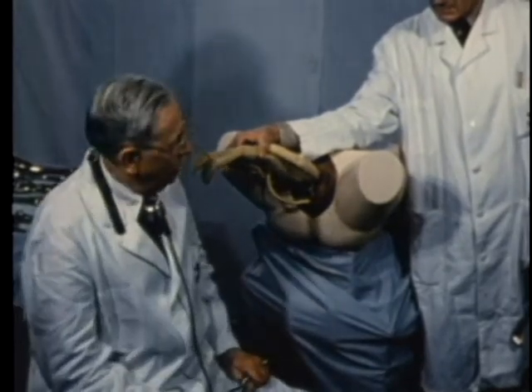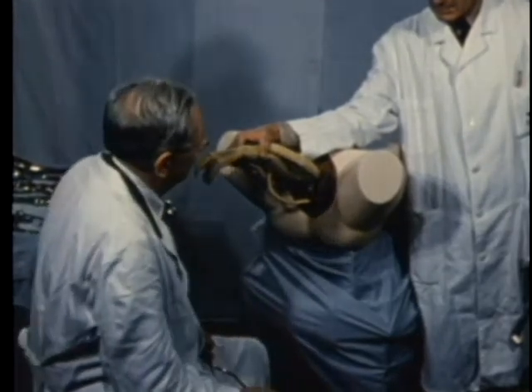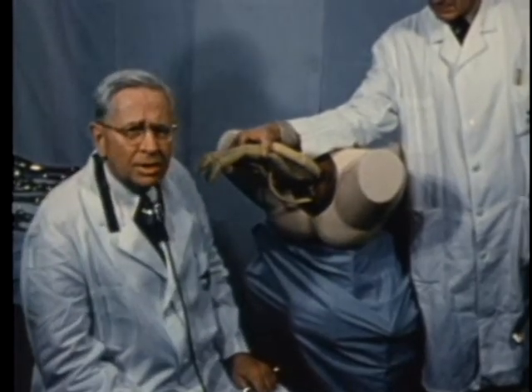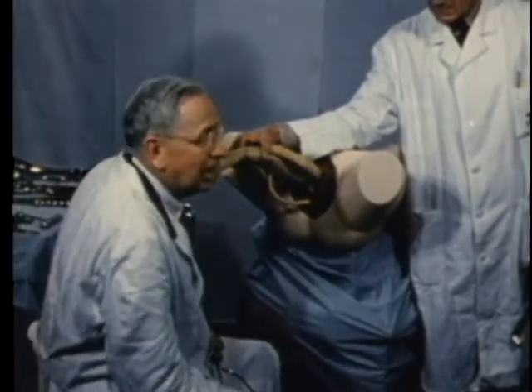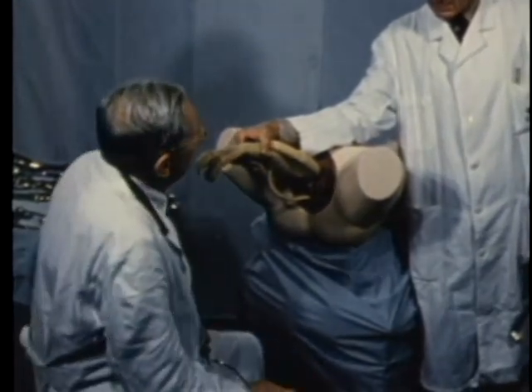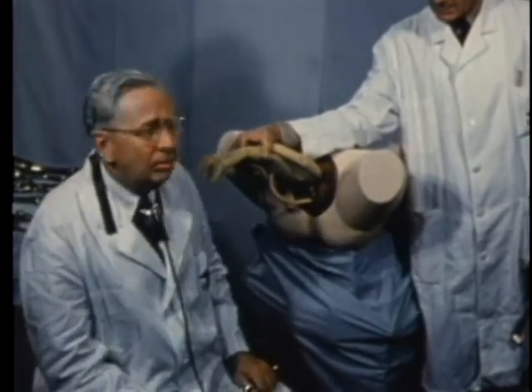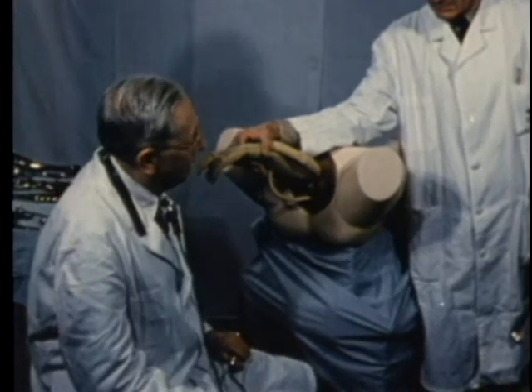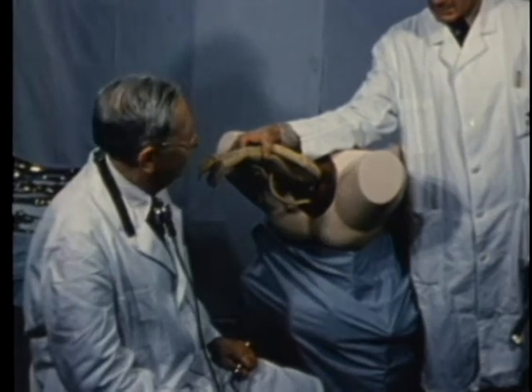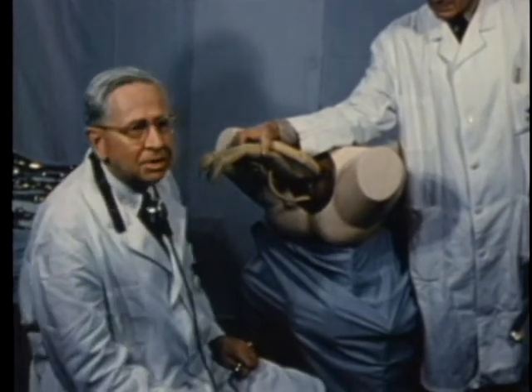The operator assumes the sitting position. Piper advised the kneeling position, and he stated that when one is confronted with a situation of this gravity, it is advisable to adopt the attitude of prayer. But during the course of the years, it is found it's a little more comfortable to sit down in making the application, and one isn't under any great stress as he would be if he was on his knees and felt that he had to get off the floor without assistance.